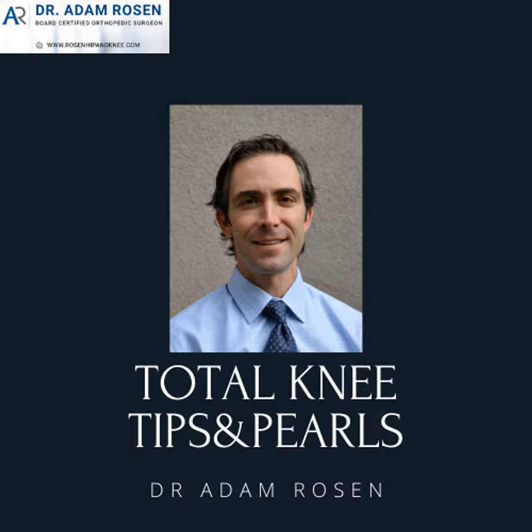Again, like the femur, if it doesn't want to come up because it is attached at one area or the other, stop, hit it back down, go back and see if you can break up that tibial interface where the bone is and try to preserve the bone as best as possible, but then remove it.